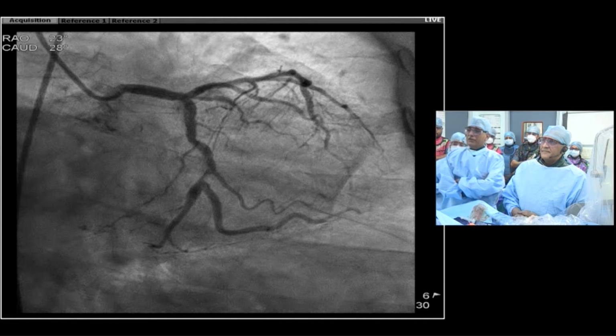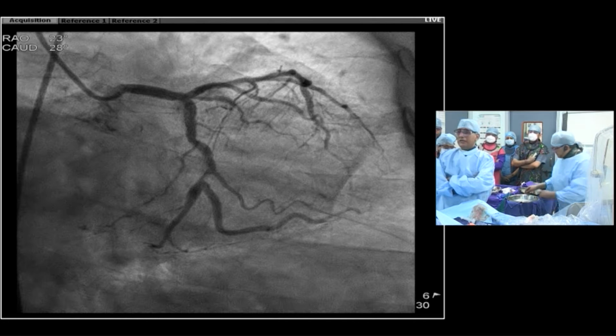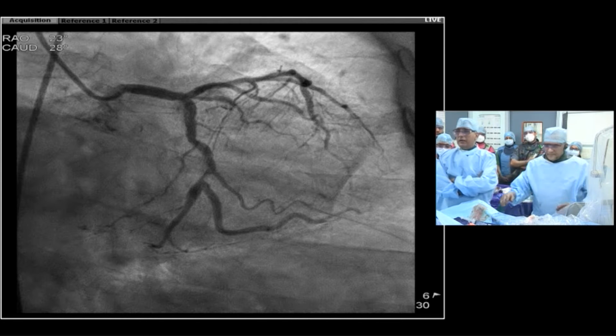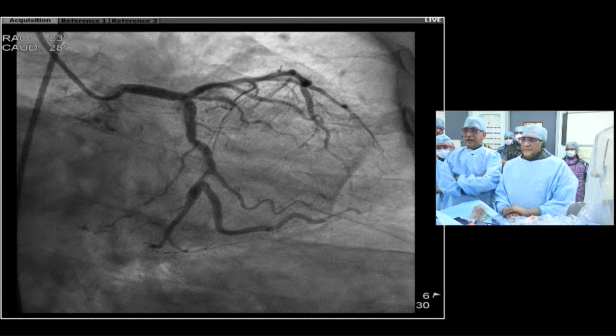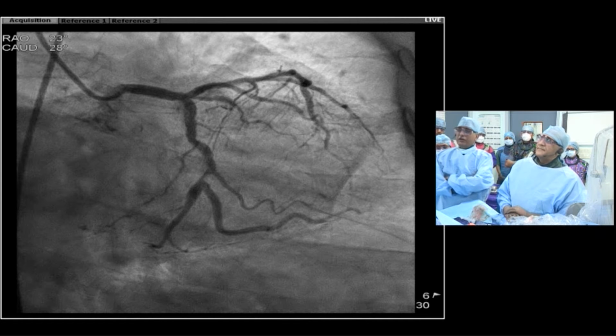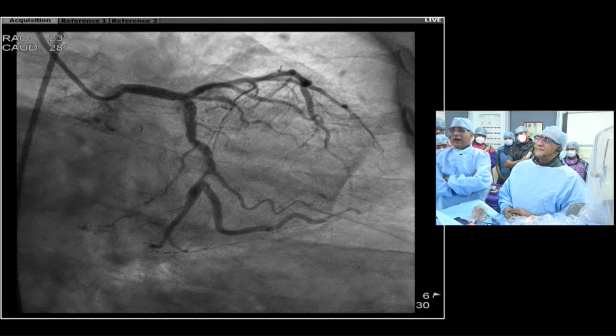The microcatheter did not cross into the OM, so we parked it in the distal circumflex, and we had taken a 1.25 burr, and despite at least 10 to 12 runs of a 1.25 burr, we had modified the plaque so much that I thought I'd be able to deliver a balloon, but the balloon could not get a desirable result. Possibly there is exophytic calcium there, and I realized that the right is not going to be done with that procedure, and probably needs a laser for modification to be able to open the right. So we decided to defer the procedure and come back another day.